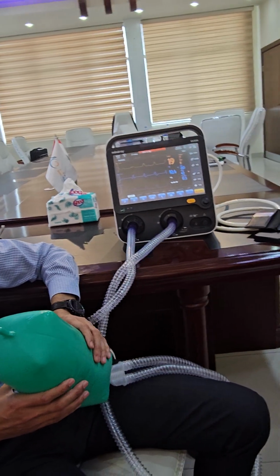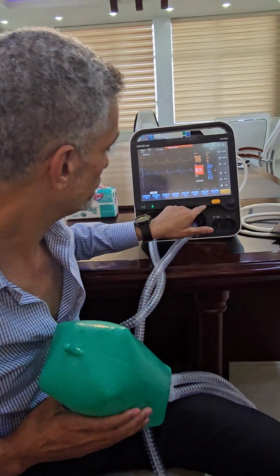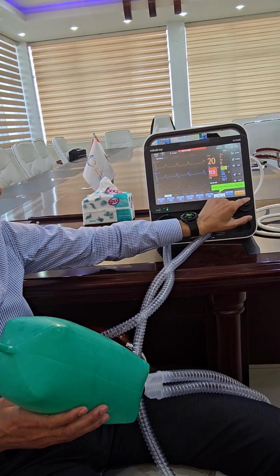With assist off, the pressure wave will be regular. And this is the trigger, how much the patient triggers. We can change it to flow.